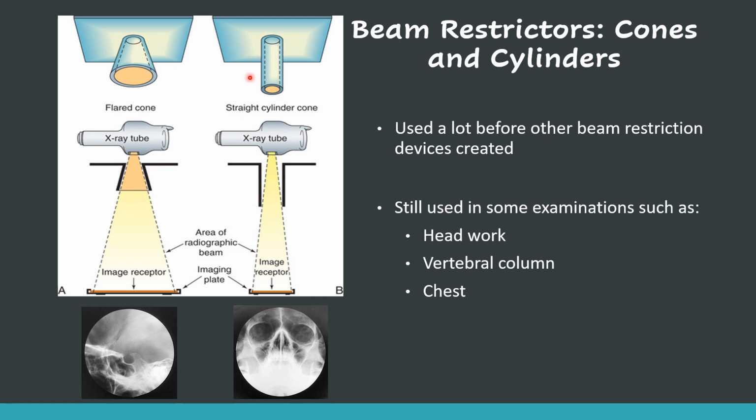This is the cylinder cone here, and the flared cone up here. We really don't see these much anymore, except at older facilities or maybe in the lab. Or as you see here, they're used for head work.